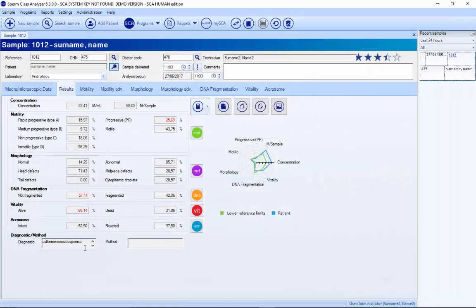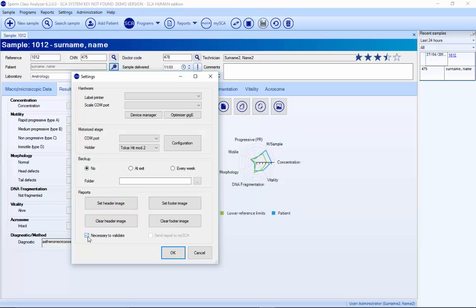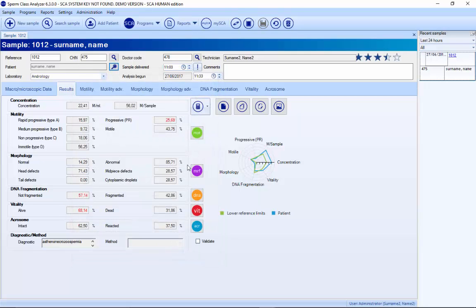When we have all the results, it's possible to configure a validation requirement in settings. A user with validation rights can check that everything is correct, and when they press validate, the results automatically go to the LIS system. It's possible to connect to different databases, and when you press validate, everything automatically goes to the hospital database.